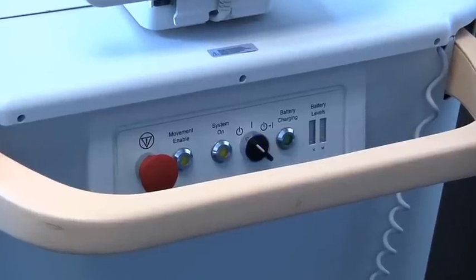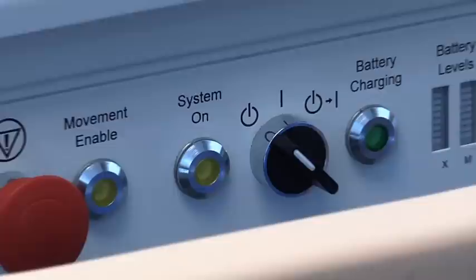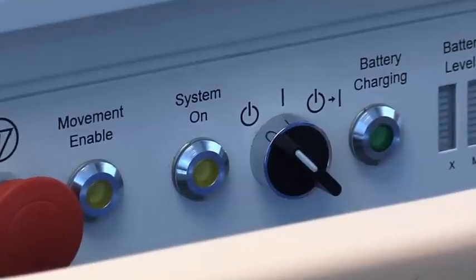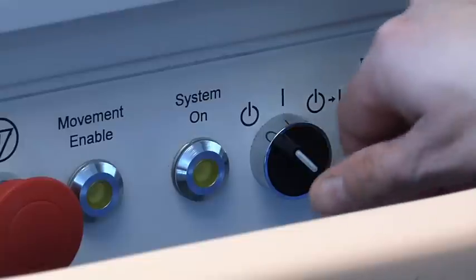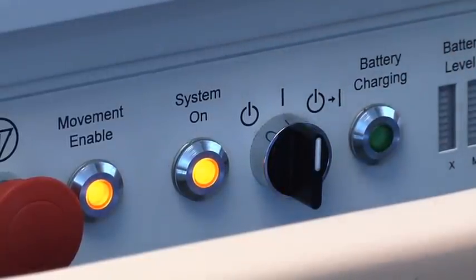The power switch for the OARM image acquisition system is like the ignition switch on an automobile. You turn it once completely to the right, then let go. The movement enable and system on indicators will light up. Now you can drive the system.